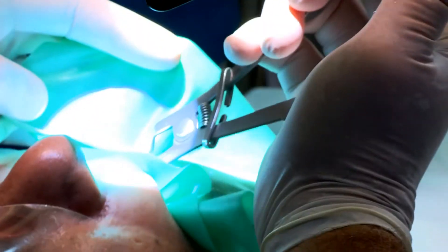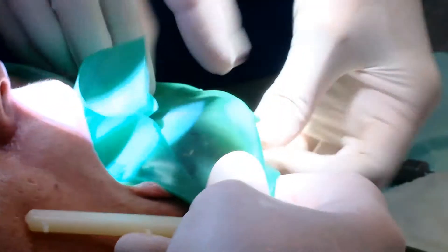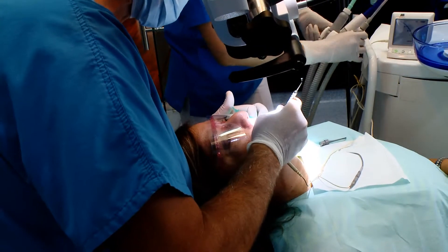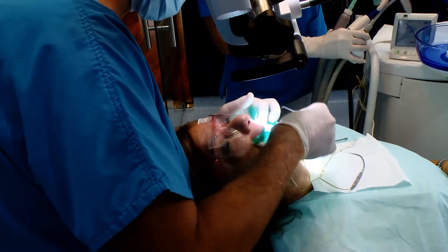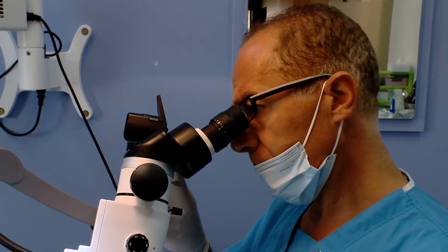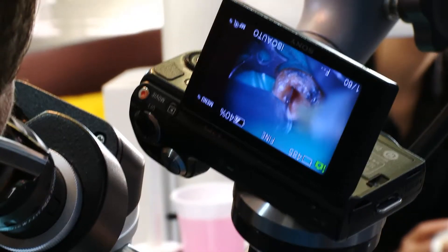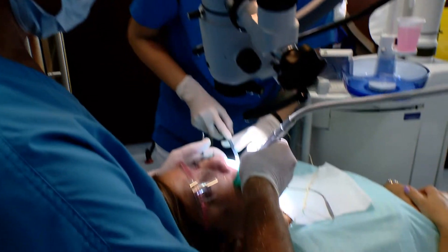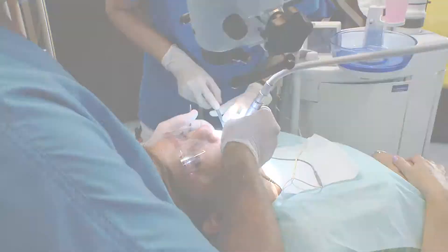The treatment starts after isolating the tooth with a rubber dam, which is a sheet of dam that covers the entry of the mouth to protect the patient's throat and lungs from inhaling or swallowing any debris or antiseptic that might be used during the procedure. This has been shown to contribute largely to the success of the endodontic procedure.